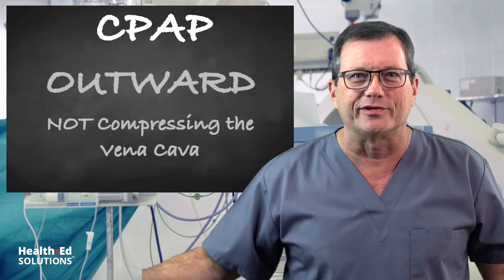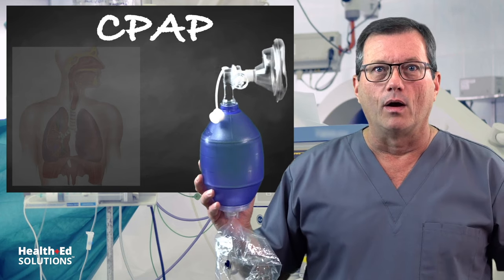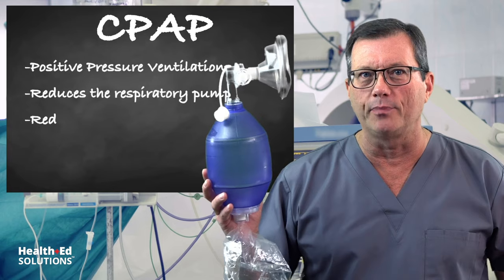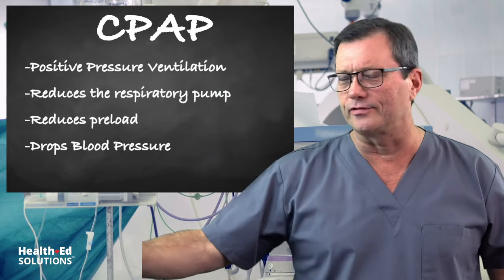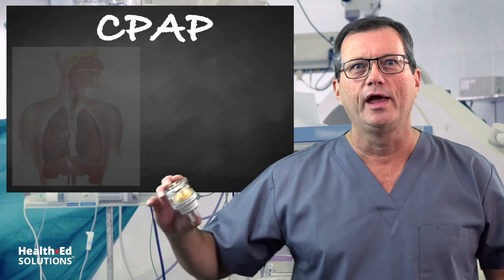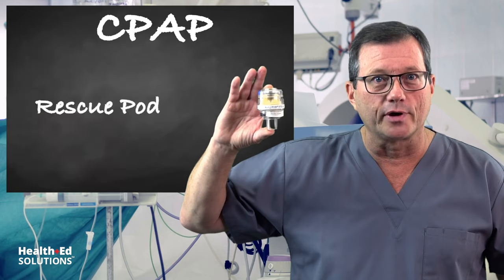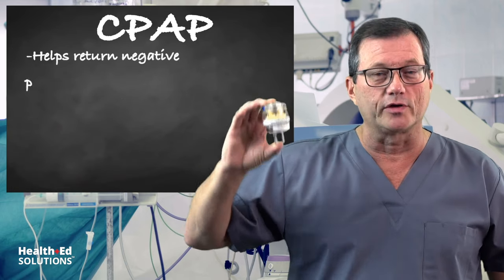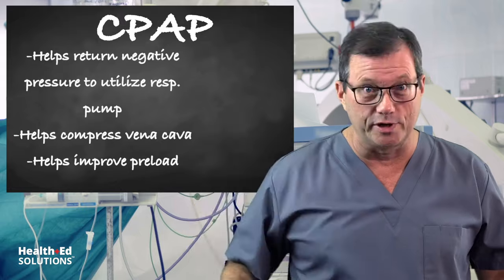Positive pressure ventilation reduces the respiratory pump, reduces preload, and drops your blood pressure. That's exactly what happens every time you're bagging somebody. This device — the rescue pod — helps return some of that negative pressure so we can utilize the respiratory pump, compress the vena cava, and improve preload.